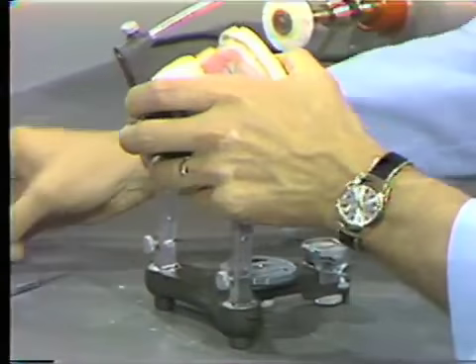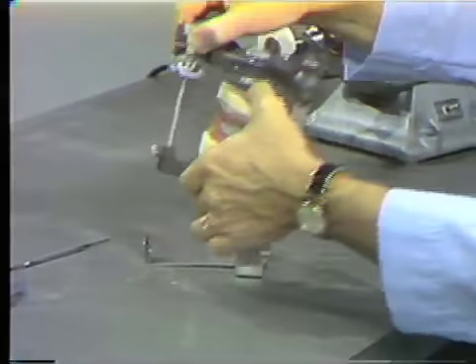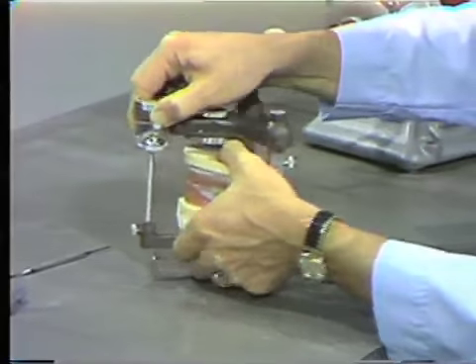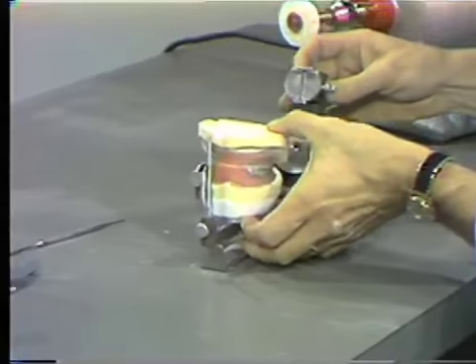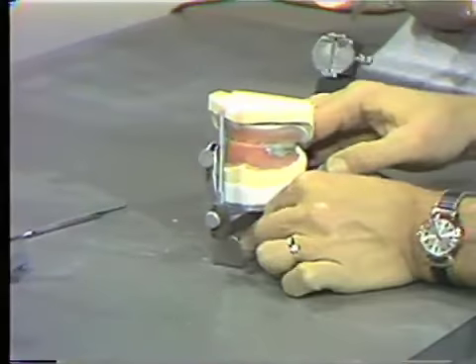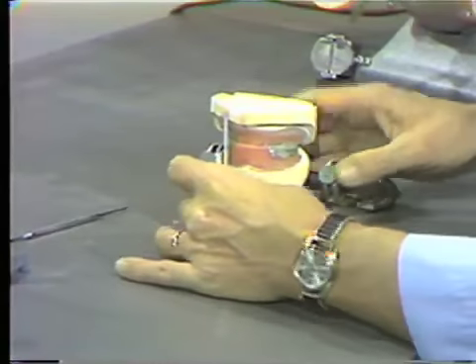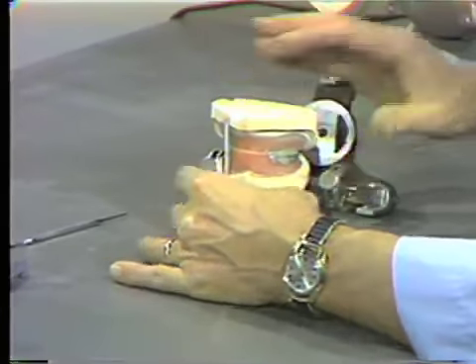Now we will use the mounting stand, place the articulator on the mounting stand, and we now can open the lower member, and we're ready to mount. Be sure your upper is correctly seated and tight, and everything is secure.